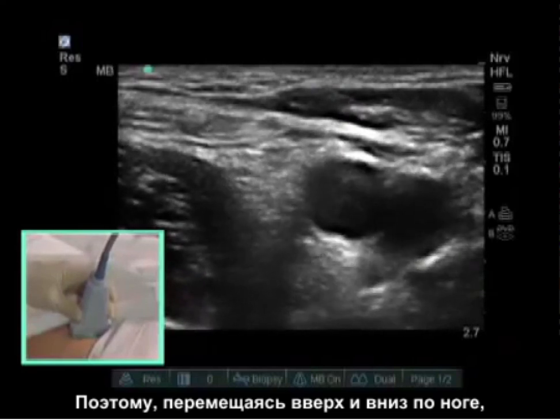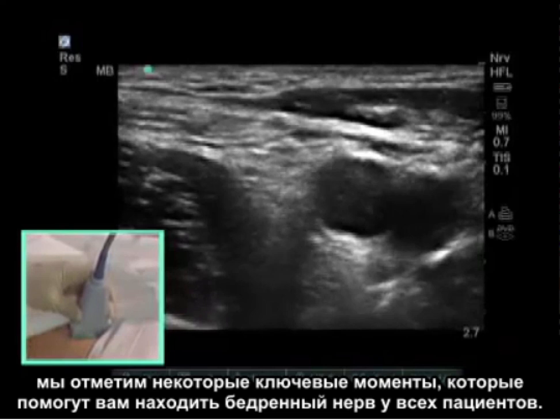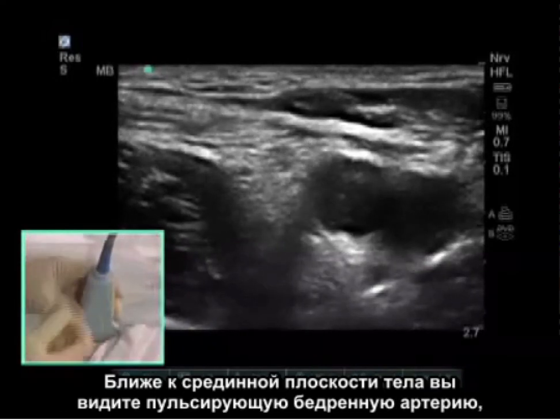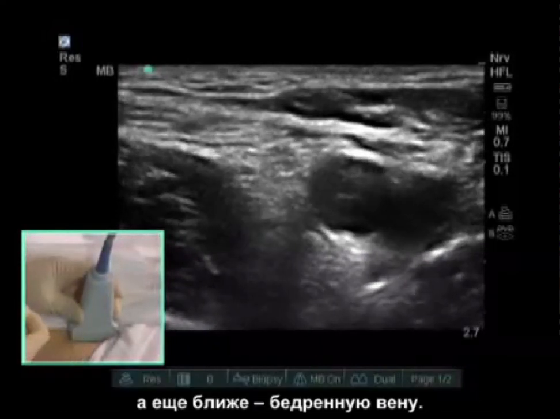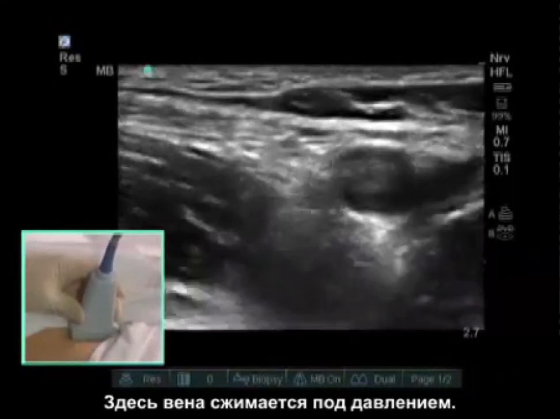As we move up and down the leg, we're going to see some keys that will help you find the femoral nerve in all patients. More medial, you see the pulsating femoral artery, and medial to that, you see the femoral vein. The vein collapses with pressure.